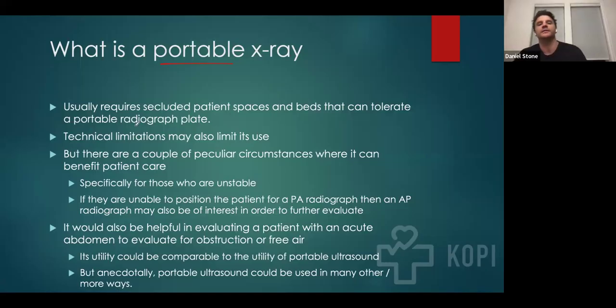Portable chest X-ray is a very important tool that should be used mostly for patients who are unable to tolerate walking. It does require a certain type of machine as well as certain type of radiography plates.